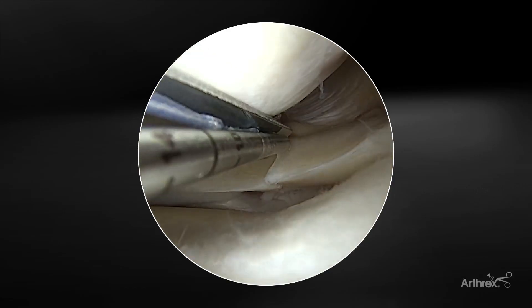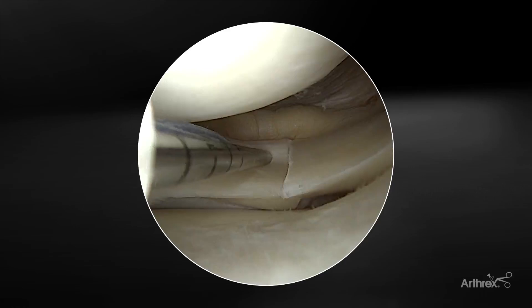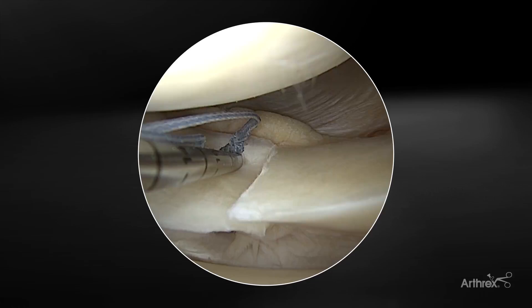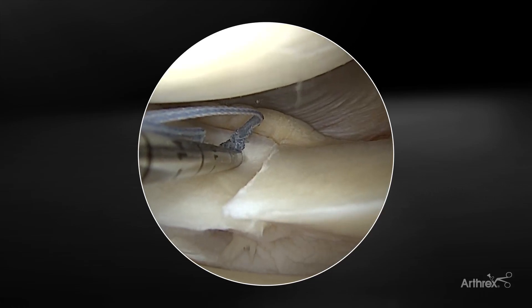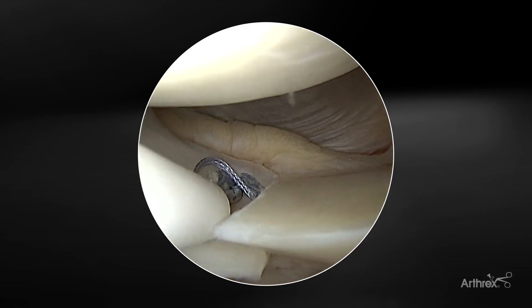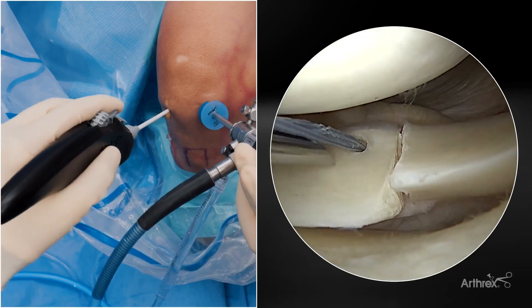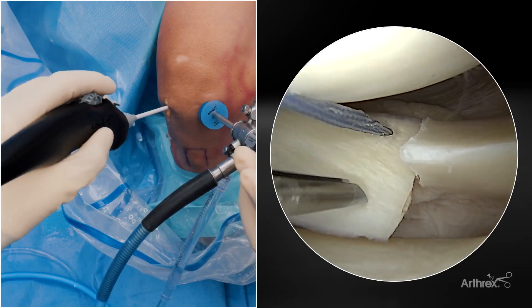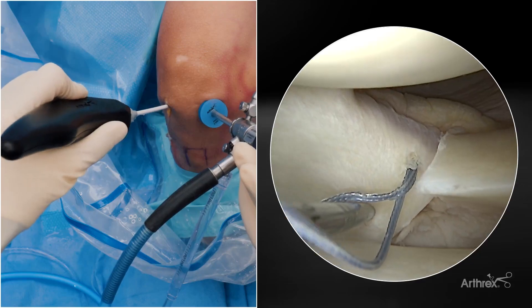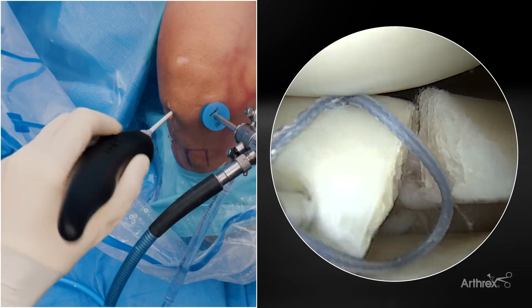In order not to injure the condyle, I'll typically flip it like that to bring it in. I'll get as close to the radial tear as possible, puncture into the meniscus tissue, and then reduce the meniscus. For a radial tear, you want to provide compression, so you don't want to distract the position of your implants by directing it more laterally. We're going to go through the capsule, directing a little bit more centrally or medially — and here we're deploying our first limb, then coming into the meniscus tissue for our second, utilizing the curve to puncture the tissue.